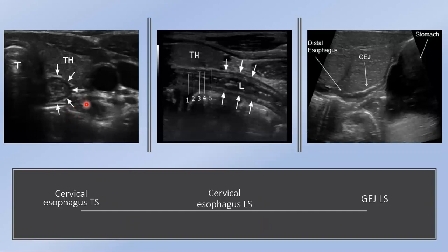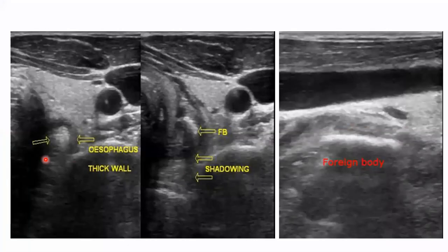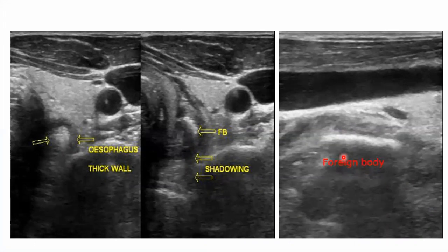This ultrasound of the neck shows the cervical esophagus in transverse and longitudinal sections. This is the gastroesophageal junction in longitudinal section. Here the esophageal wall is thickened, and a foreign body is impacted in the cervical esophagus with posterior acoustic shadowing — the longitudinal section shows a linear echogenic focus with posterior acoustic shadowing.